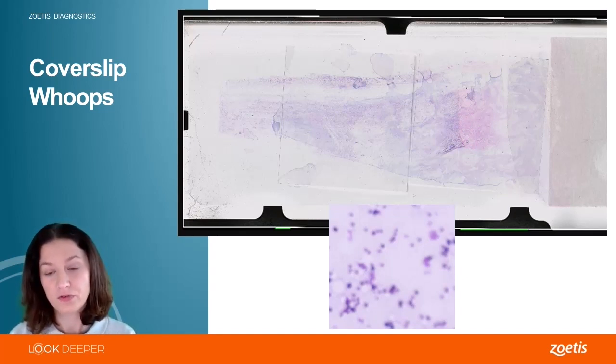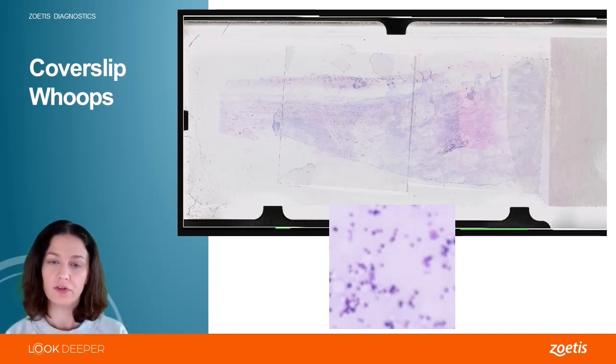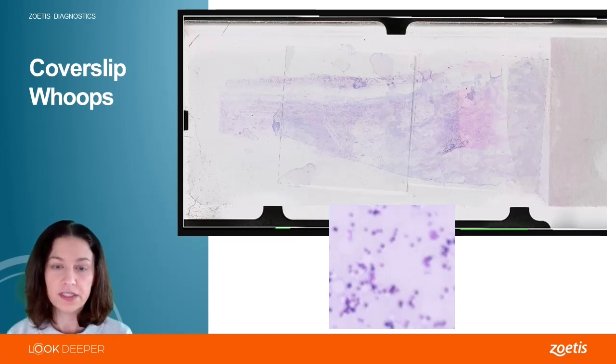But from the slide overview, what I can tell is that there are two square cover slips like we talked about before. And the problem with this one is the Imagyst specific cover slips are the full length of the slide, and they are a particular thickness for the Imagyst scanner. When we start to get away from those and use different cover slips or these little square fecal cover slips, the thickness is usually off, so the Imagyst can't scan and focus through them as well as it can for the cover slips that are specifically made for it. Those are provided to you free of charge from Zoetis. If you need more, just reach out to your representative. But it's so important for scan clarity to be using those cover slips.